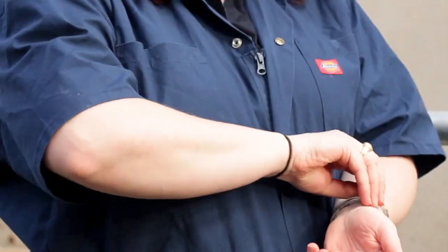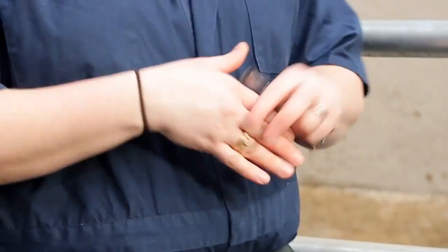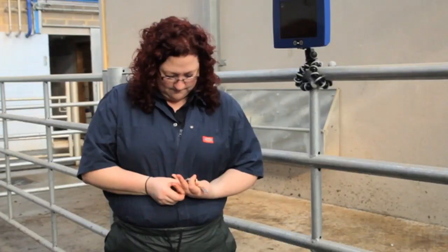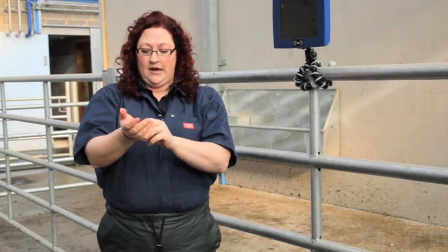Next thing that we need to consider before we get scanning is the way that we're dressed and the environment that we're in. So looking at actually getting ourselves ready, we need to make sure that we remove any jewelry, including watches and rings, and put them in a safe place. Next, we need to make sure that we tie our hair back for the ladies, and get it out of the way.